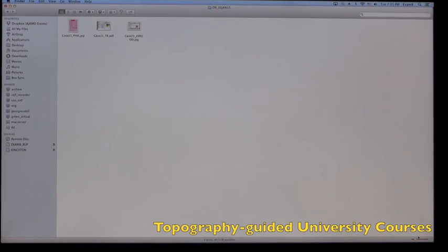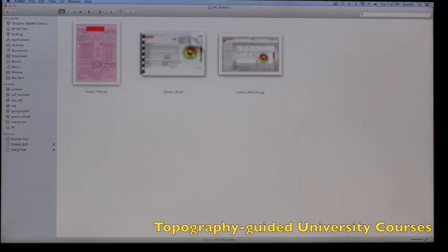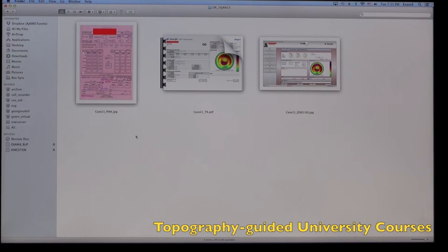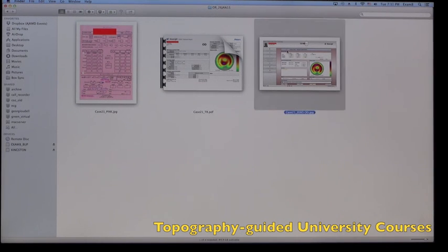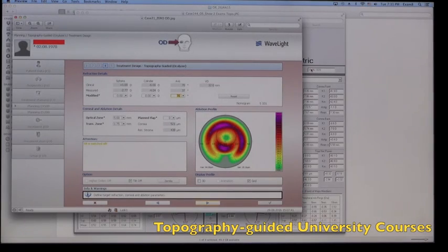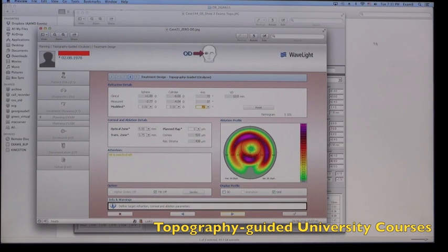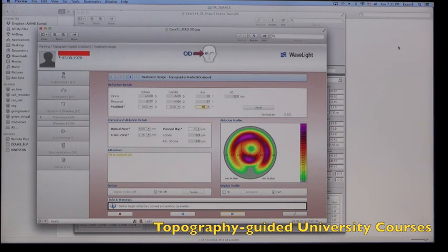And then we'll click on the OR, where again we have our flow sheet of refraction, and on the far right, let's click on that, the topography-guided suggested correction if we zero the sphere and cylinder.